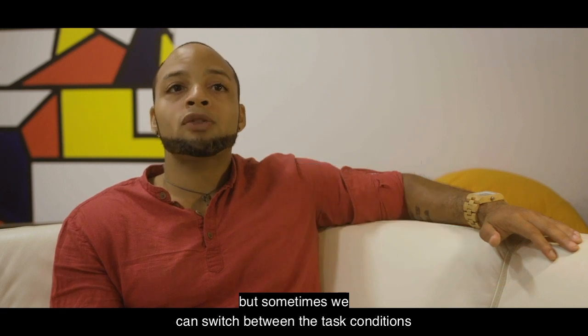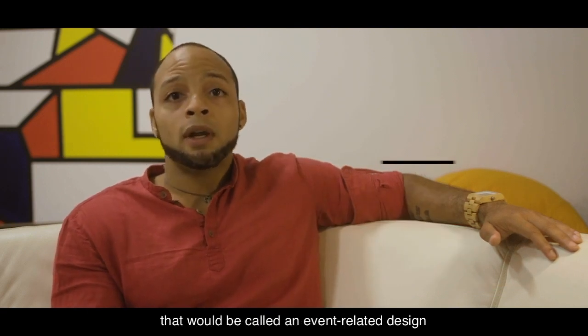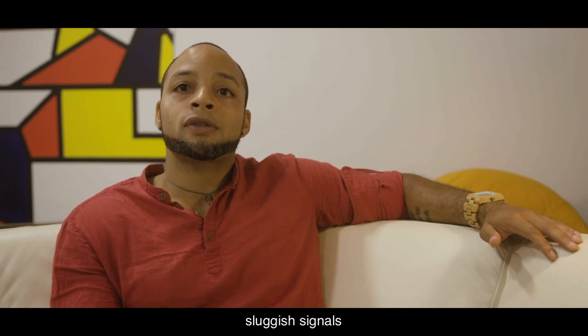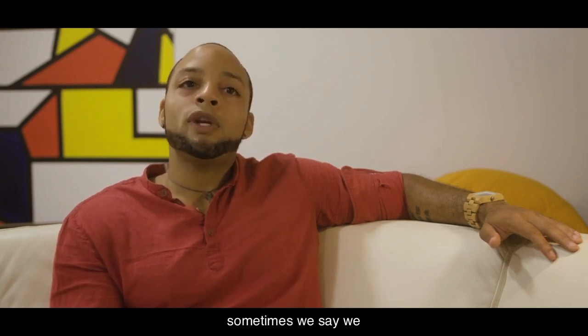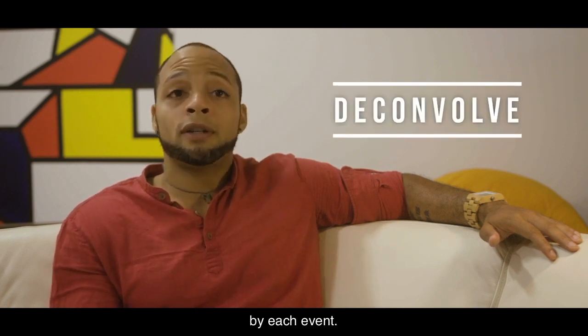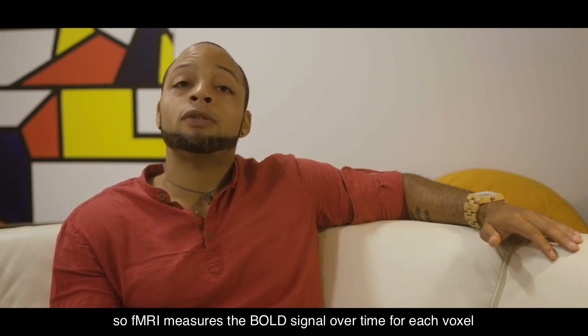But sometimes we can switch between the task conditions faster, say every few seconds. That would be called an event-related design, in which we have to mathematically sort out the delayed sluggish signal which may overlap each other. Sometimes we say we deconvolve such signals, so we know how much activity is caused by each event. So fMRI measures the BOLD signal over time for each voxel.